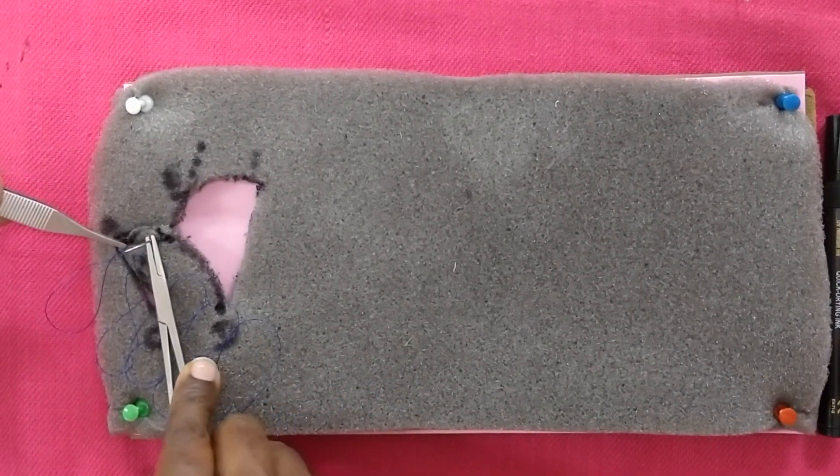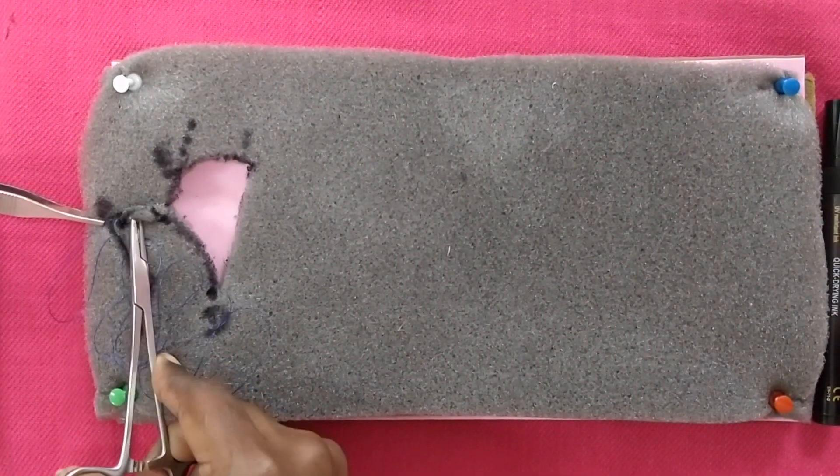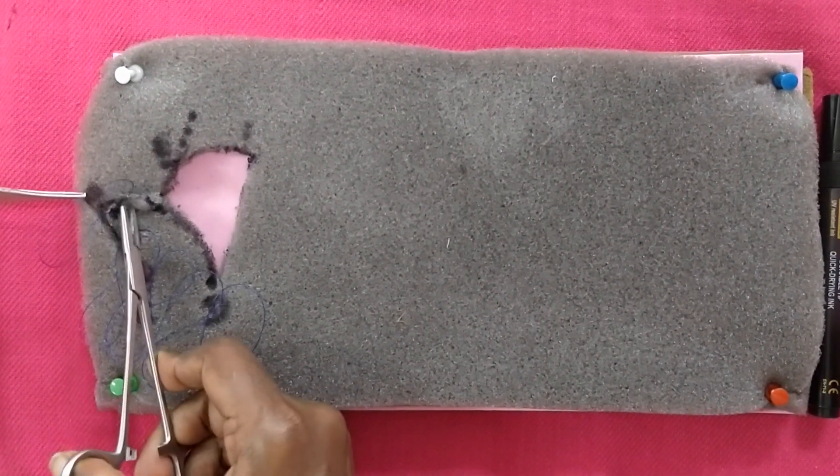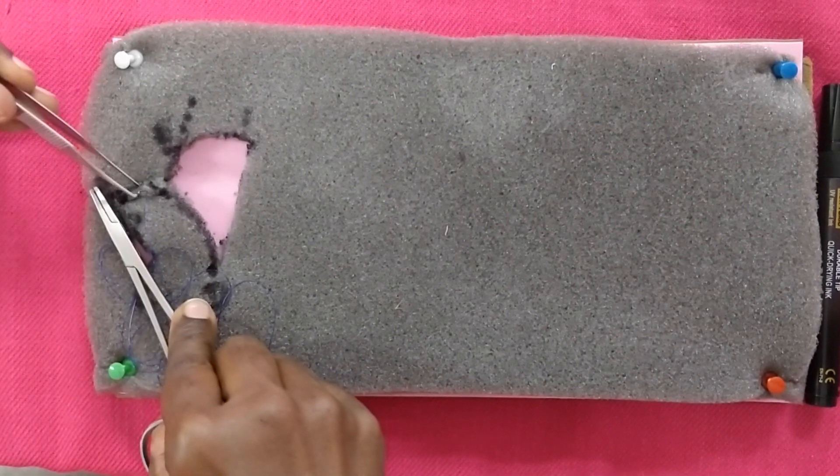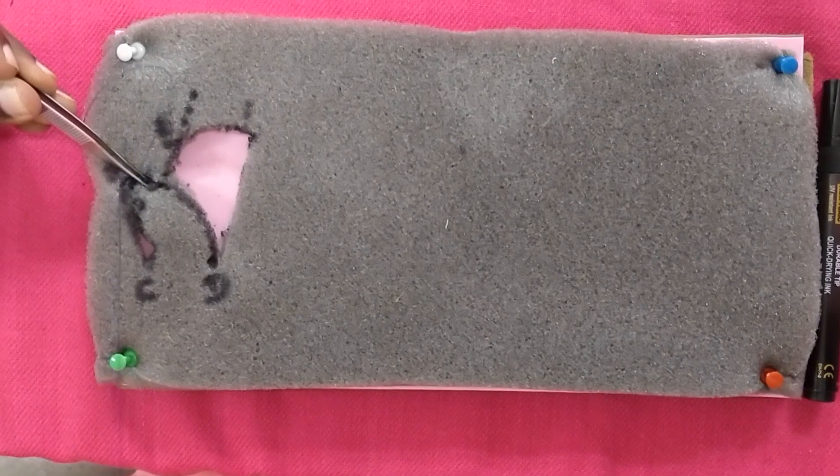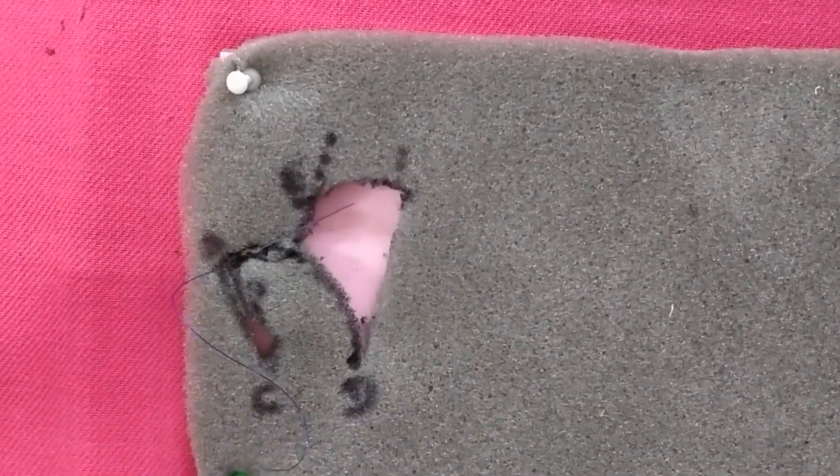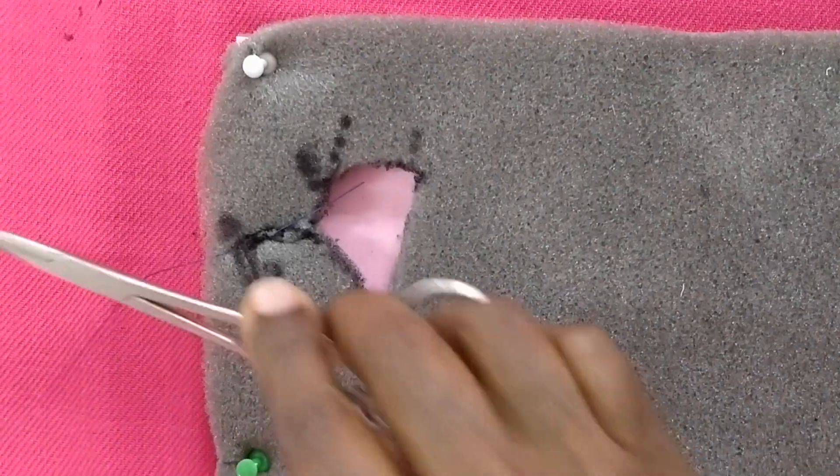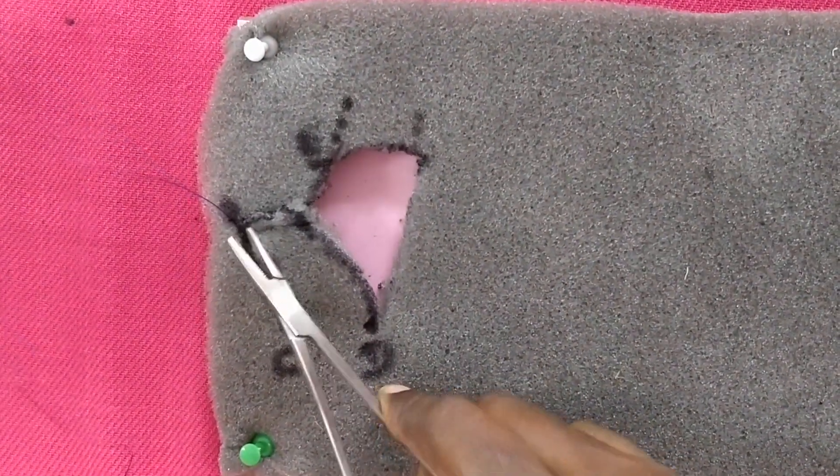The point E is now sutured to the point A. It is important to avoid any tension on the flap. As I was talking to you about the dog ear that forms on the side A, C, because of discrepancy in size. This point of dog ear has been dealt with in detail in the video on transposition flaps.